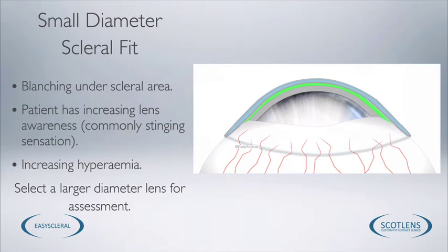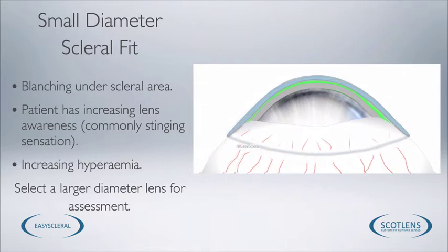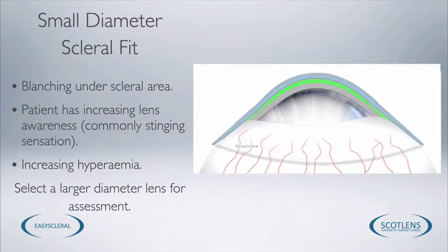If you've selected the 16mm, and we've got a more extreme corneal ectasia, sometimes the increased bearing, the weight of the lens effectively pushing down on the very narrow fitting area of the 16mm, can cause blanching of the blood vessels. So you'll see that the scleral angle is actually parallel to the eye, but blanching is still occurring. In this case, you would want to select the 18mm. This will spread the area and the weight of the lens over a bigger area, so you shouldn't experience blanching.